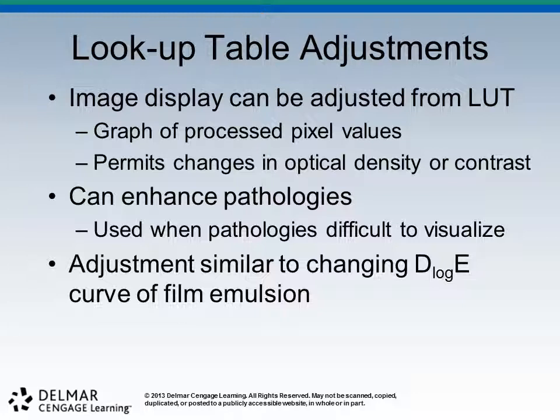So the LUT helps to fix some of that. Sometimes, if it's pre-programmed properly, it'll give you the opportunity to enhance those pathologies. Here's something that we all need to understand, and sometimes I even forget this. The contrast sensitivity of digital imaging is so much more sensitive than that of our eyes or that of film.